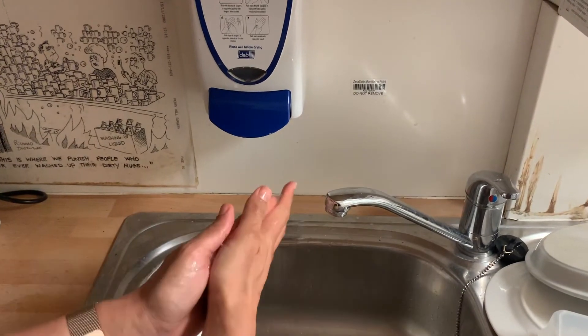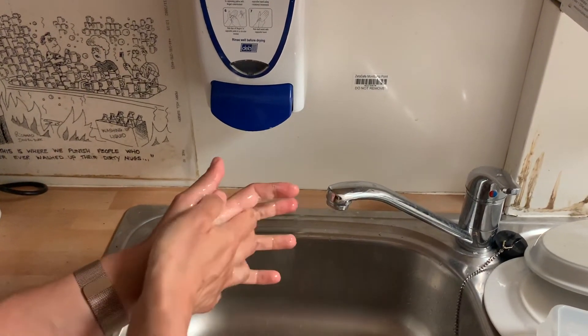Before taking a measurement, it's important to wash your hands for at least 20 seconds with water and soap.